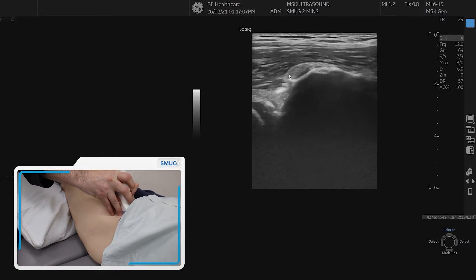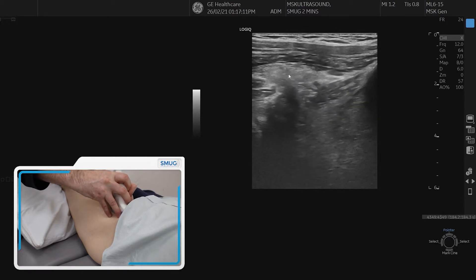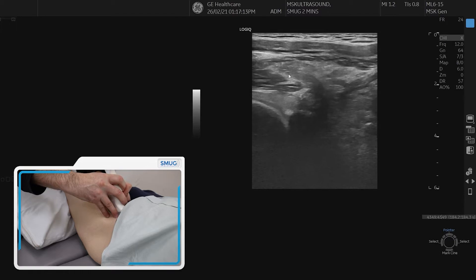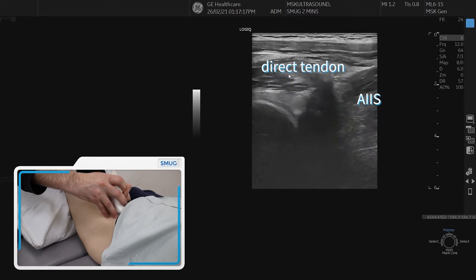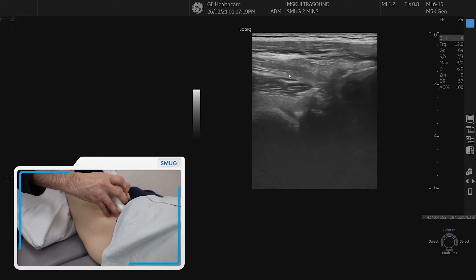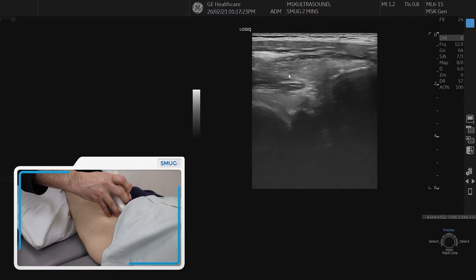Once you have the bone in view, you can start optimizing. You probably have to look closely at how you can best align the tendon, because it has a specific angle to really find. There it comes — so that's the tendon now aligned. You can see the bony attachment on the right side.